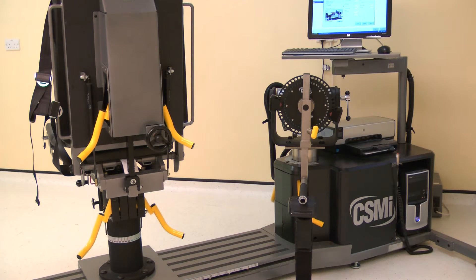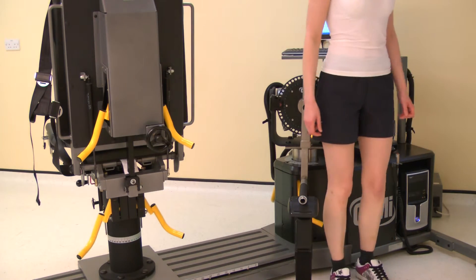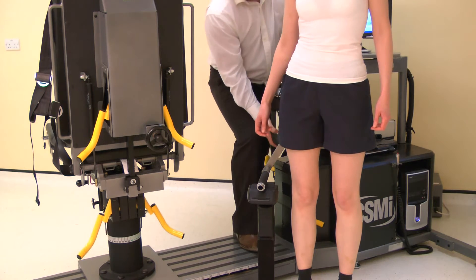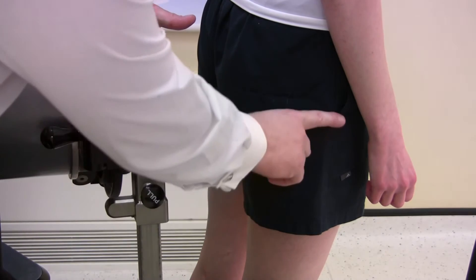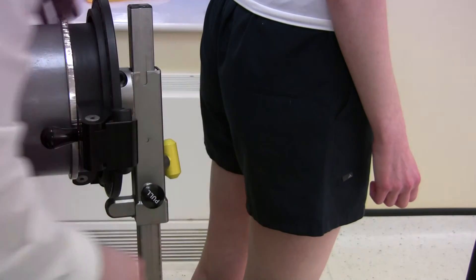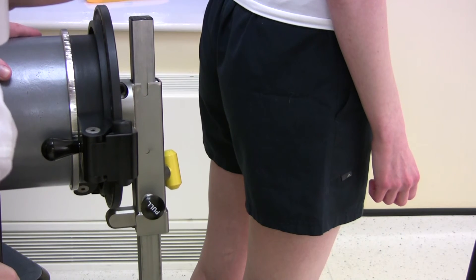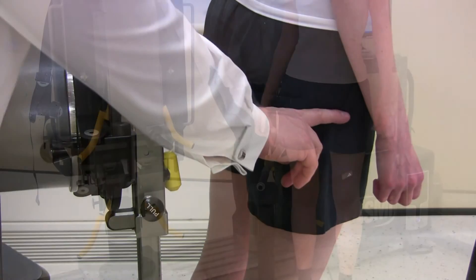Ask the subject to stand next to the dynamometer. Now the axis of rotation needs to be set. The axis for the joint needs to be directly opposite the black dot on the input arm. The axis of rotation for the hip is superior and medial to the greater trochanter. The dynamometer height and subject position may need adjustment to achieve the alignment.